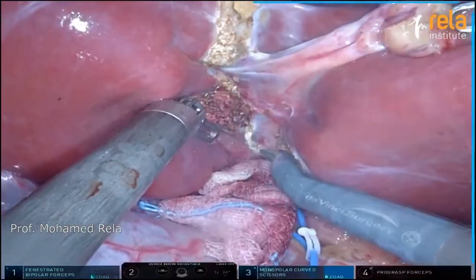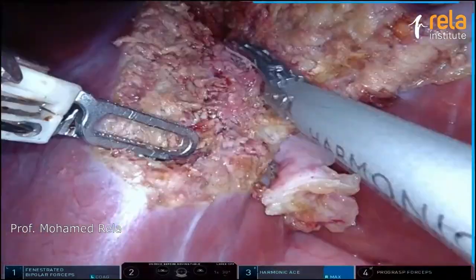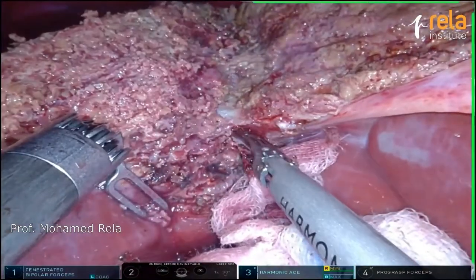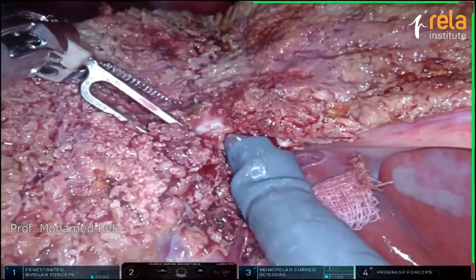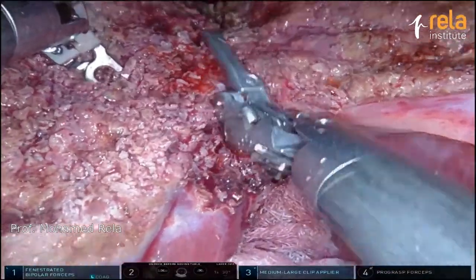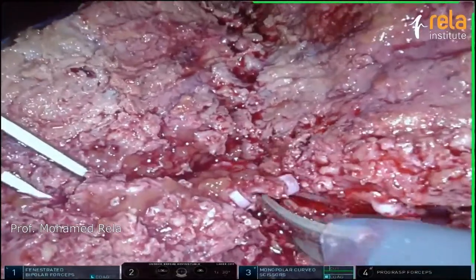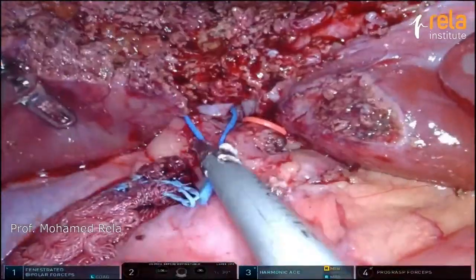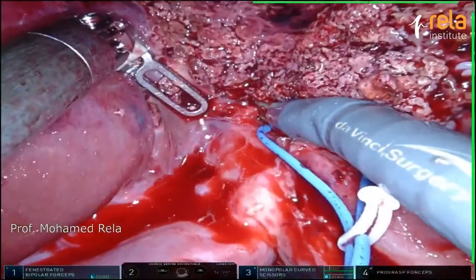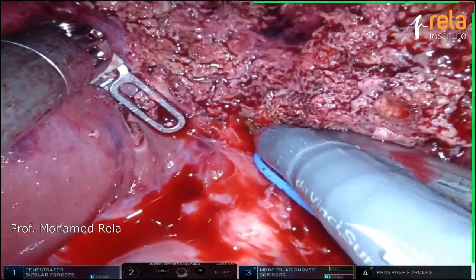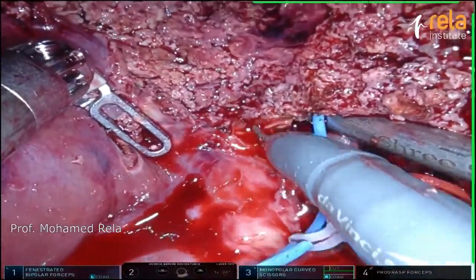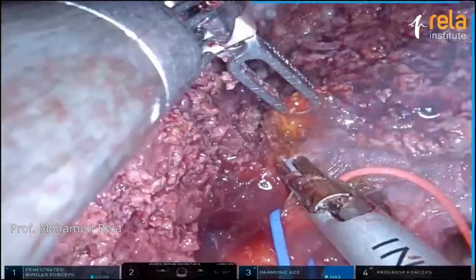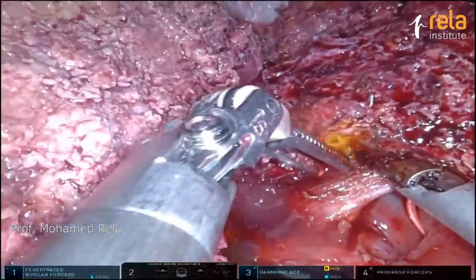This time we are going to use the harmonic, which comes with the XI system. They're not wristed though — they're very rigid. I don't like it and I also don't really like the transection using the harmonic. My preferred way is really the bedside surgeon using the CUSA. The transection is very messy — you have to keep sucking in between. There you see the left duct being divided. If you want a more accurate division without bleeding, you could also do a Pringle at the time of duct division — that causes less bleeding.